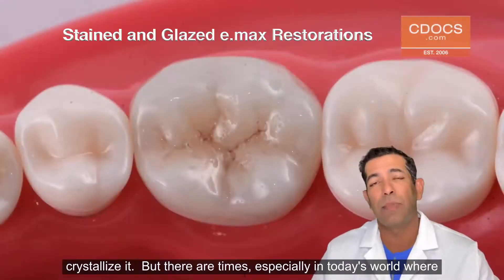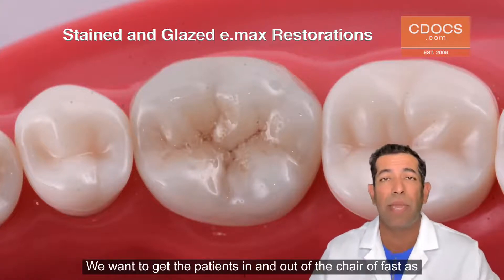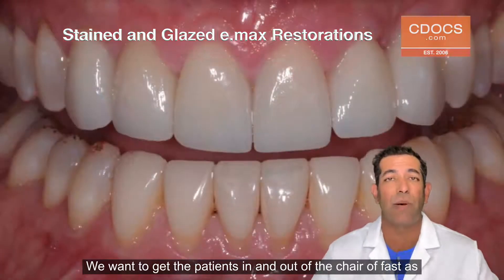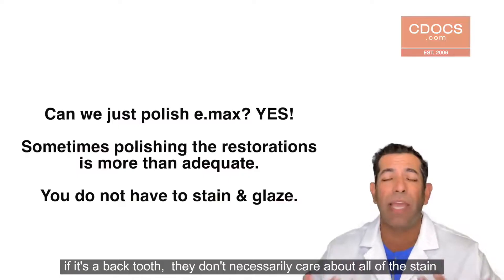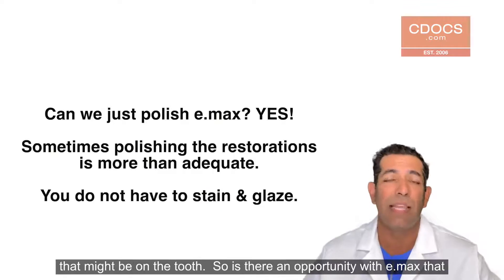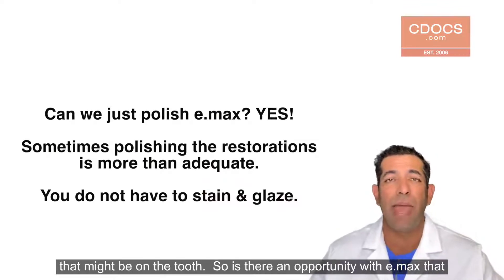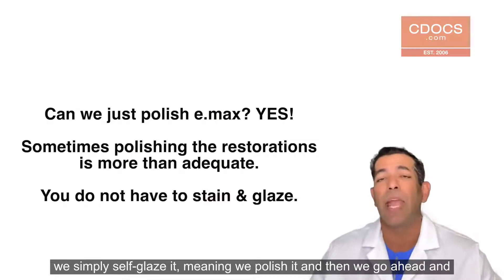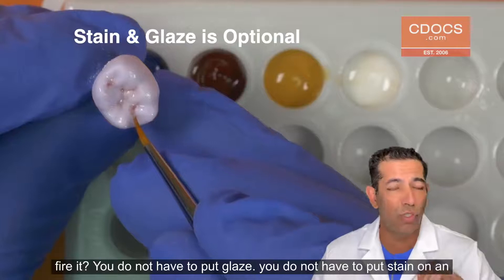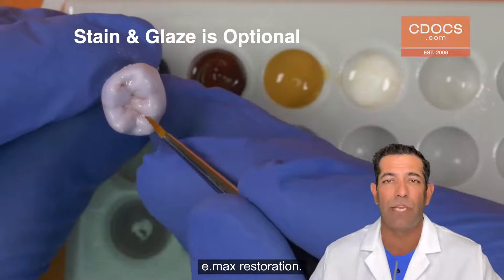But there are times, especially in today's world where speed is an issue, we want to get the patients in and out of the chair as fast as possible. And most patients, if it's a back tooth, they don't necessarily care about all of the stain that might be on the tooth. So is there an opportunity with eMax that we simply self-glaze it, meaning we polish it and then we go ahead and fire it? You do not have to put glaze, you do not have to put stain on an eMax restoration.